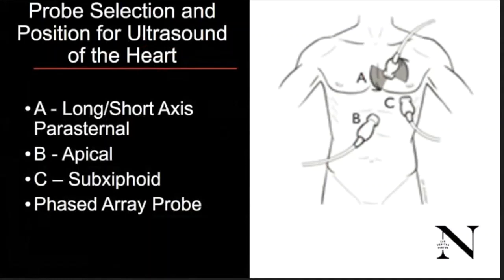And I want you to think as you're doing this. For me, it's hard to remember where I'm supposed to put my marker. The way you place your marker in cardiovascular is you go clockwise from 10 o'clock, to 3 o'clock, to 2 or 3 o'clock, and then 3 o'clock again for subxiphoid, and then turn it all the way around back to the right for your aorta. And I'll show you more about that.